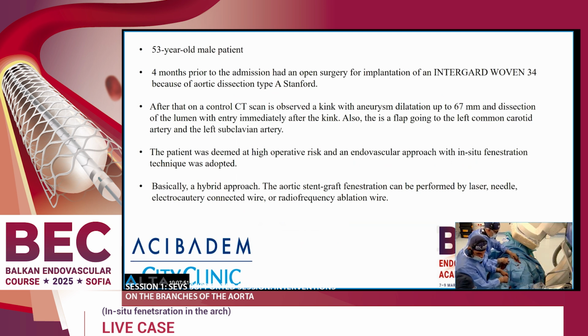Basically, the in situ fenestration can be performed with laser, with a needle, and with an electrocautery connected wire or radio frequency ablation wire. Also, something I didn't mention earlier is that when our colleagues did the first operation, they had to re-operate the patient to reposition the interposition prosthesis.